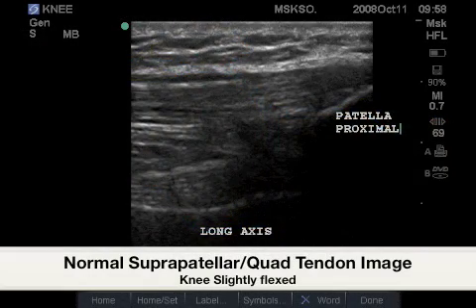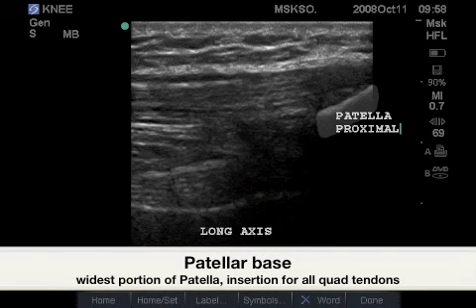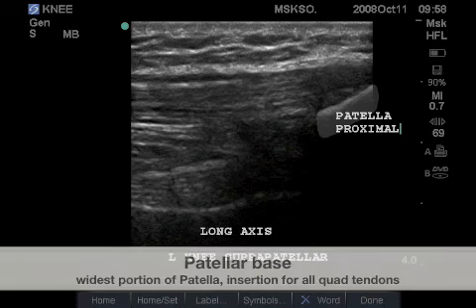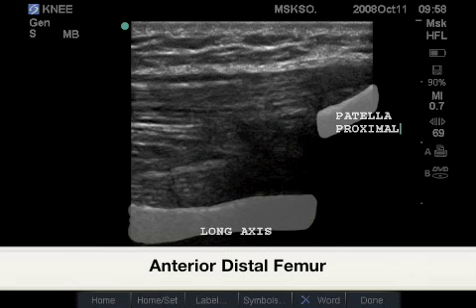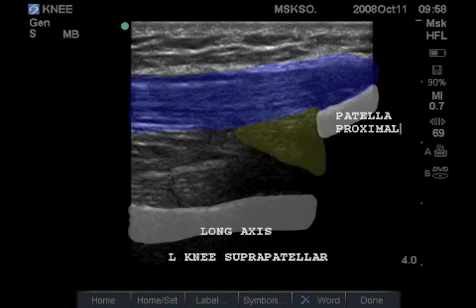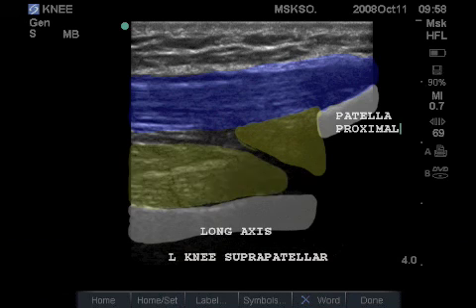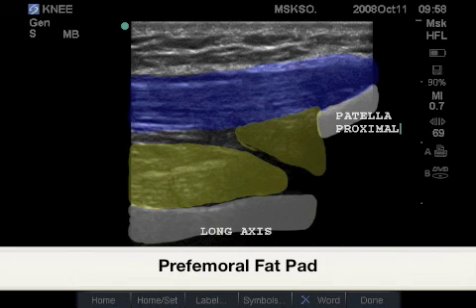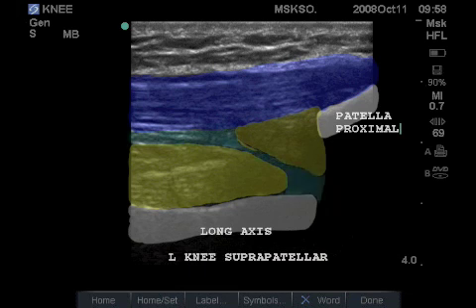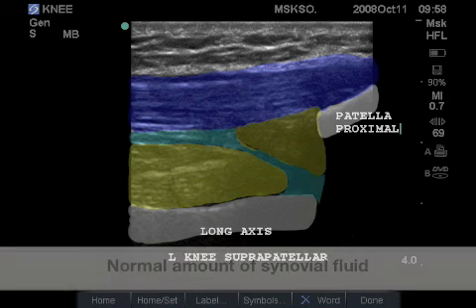Here is the corresponding normal quadriceps tendon image, as the tendon fibers insert to the highlighted patellar base, the proximal surface. Highlighted here is the inferior margin of the femur. Highlighted in blue is the fibrillar pattern of the normally situated quadriceps tendon. Highlighted in yellow is the quadriceps fat pad, and also highlighted in yellow is the perifemoral fat pad. Highlighted in light blue is the normally appearing synovial recess of the suprapatellar bursa.